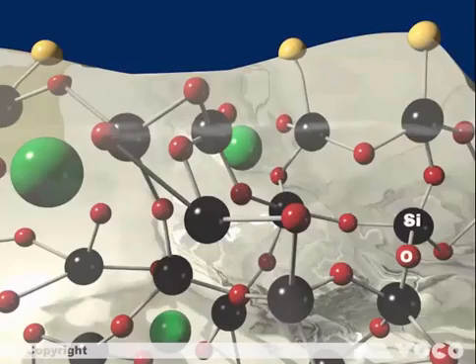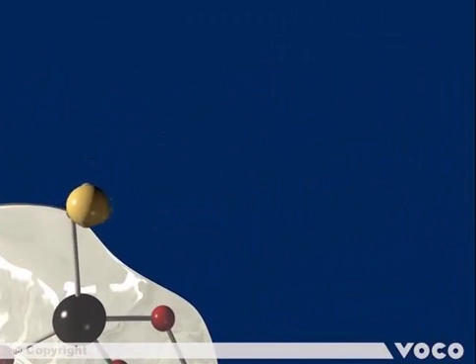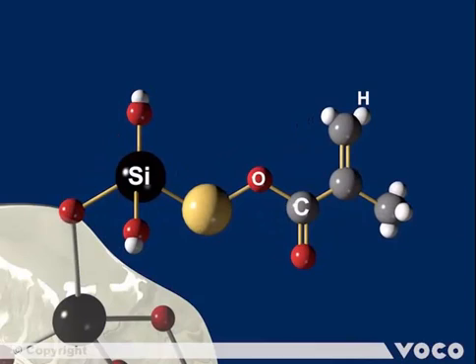The surface of the glass particle is modified, shown by yellow spheres. This special coating is done by a silanization process in an upstream reaction. Methacrylate silane compounds with a double bond are used, enabling the connection to further double bonds and thus to further elements of the matrix. The double bonds are highlighted in red.